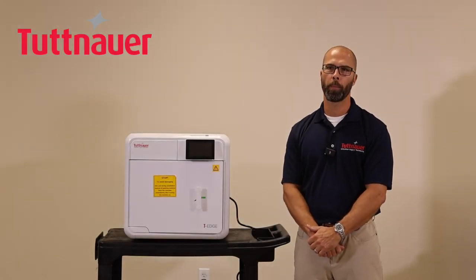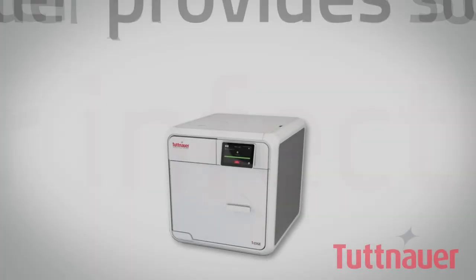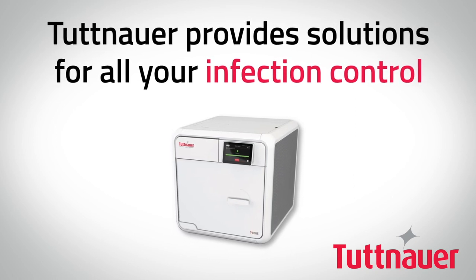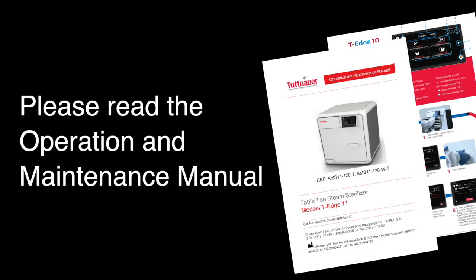Thank you for purchasing the T-Edge sterilizer by Tuttnauer. In this video we will review the basic setup, operation, and scheduled maintenance you need to know to get the most out of your T-Edge for many years to come. Please note that this video is not intended to replace the detailed instructions in the operator's manual. We highly recommend reading the operator's manual carefully.